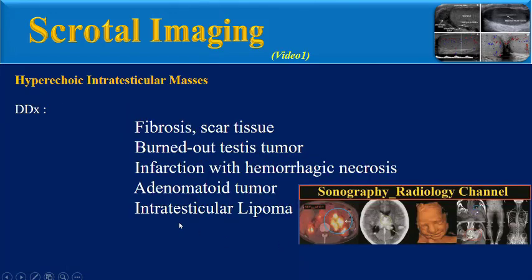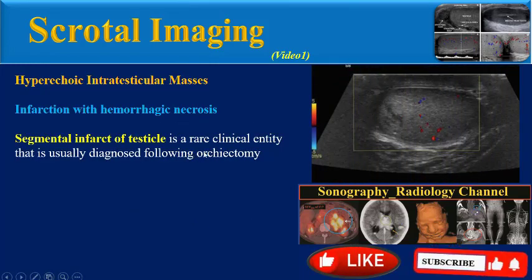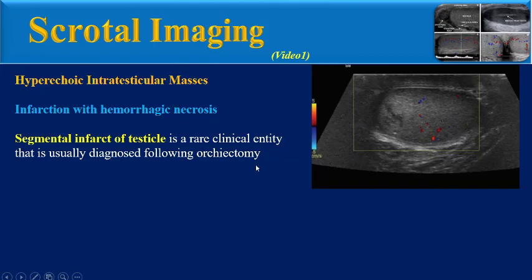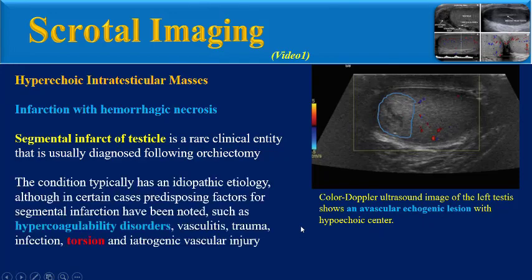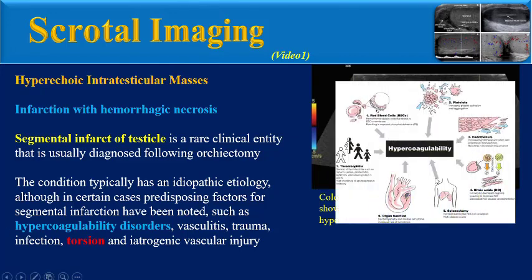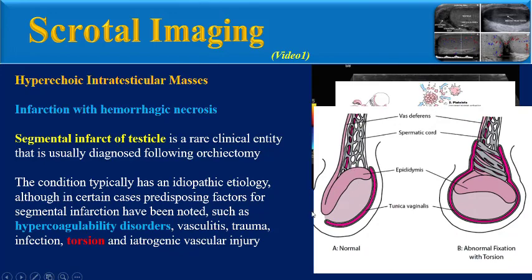Another entity is infarction with hemorrhagic necrosis. Segmental infarct of the testicle is a rare clinical entity that is usually diagnosed following orchiectomy. This color Doppler ultrasound image shows an avascular echogenic lesion with a hypoechoic center. The condition typically has an idiopathic etiology, but in certain cases predisposing factors have been noted, such as hypercoagulability disorders, vasculitis, trauma, infection, testicular torsion, and iatrogenic vascular injury.